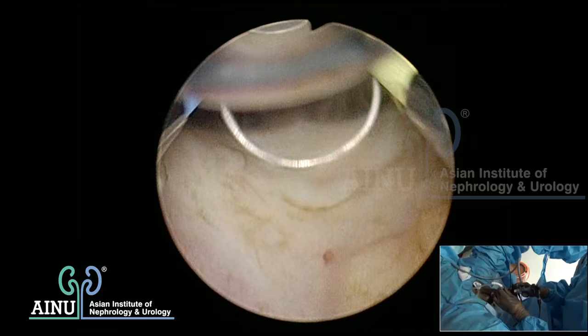Put a two-way or three-way catheter and come out. There is a little amount of tissue here - it appears to be a little lobe extending into the capsule. Sometimes it dips deep inside and may cause trouble - enucleation can be done easily in these cases but not resection. I don't see any tissue pieces or chips inside now, so I take out my scope. There was a little mucosal trauma created there.